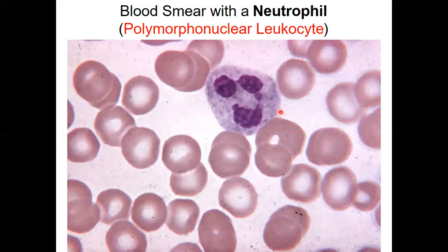So in here, I can't see it, but we can see that there are lobes, 3 lobes, 1, 2, 3. So this is a neutrophil. So draw at least 1 or 2. Now, in this case, we're only seeing 1. So it will suffice to draw 1, or just draw it 3 times if you like. Okay. But in the online link that we gave you, you may identify other neutrophils in that, and you can draw them. Maybe they may have a different shaped nucleus, but at the end of the day, these are neutrophils.